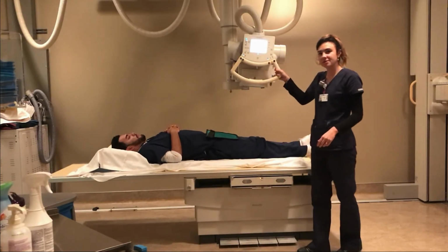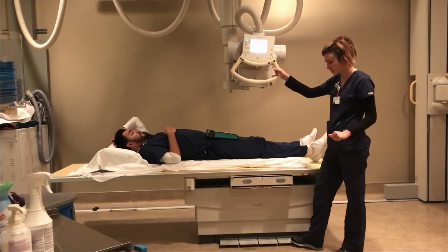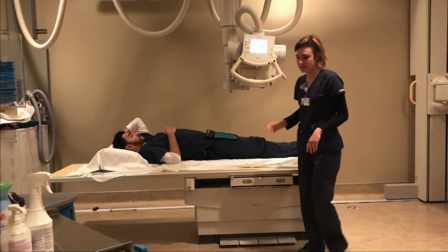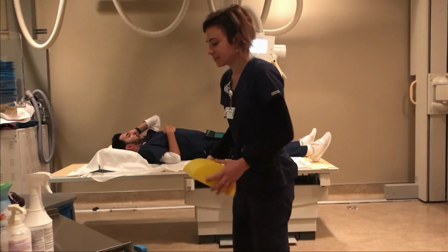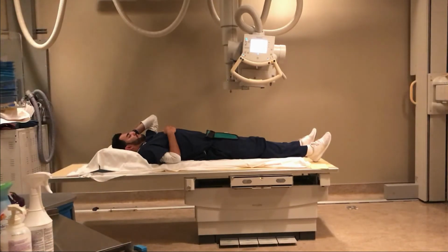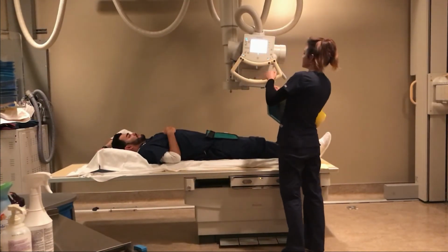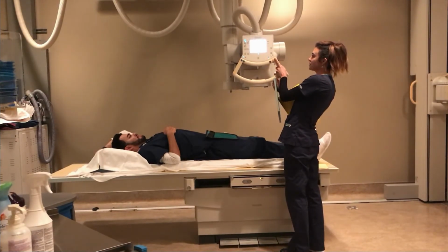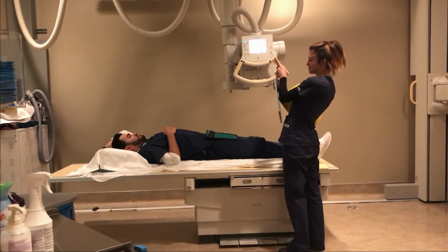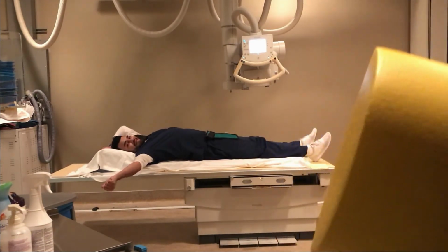So the next one I'm gonna be doing is the PA axial for the intercondylar fossa. So we won't be using a grid this time. We'll be using a free cassette. There is no tube angle to this, well, there is, but it depends. Maybe I'll see what's going on with that first.